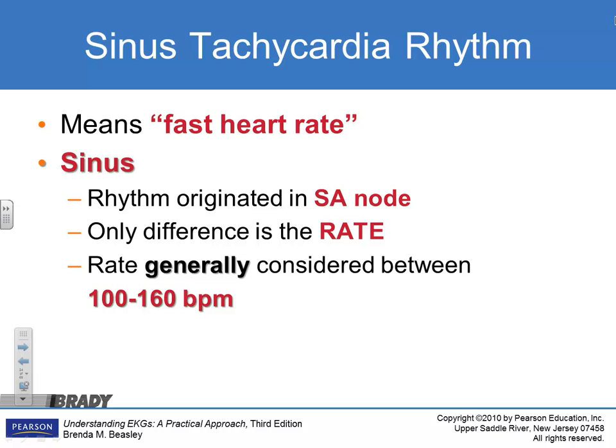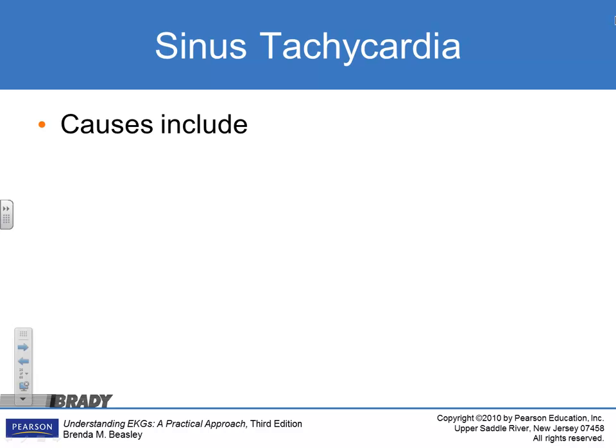It's sinus something. So SVT is like a big term that a lot of things come under. But if you can see a P wave, it's sinus tach. And I have a strip I'll show you guys one time, if I remember to bring it up, that'll shock you. Okay. So if you see this on a test, it's between 100 and 160. However, if you can see a P wave, it's a sinus, a normal shaped P wave.